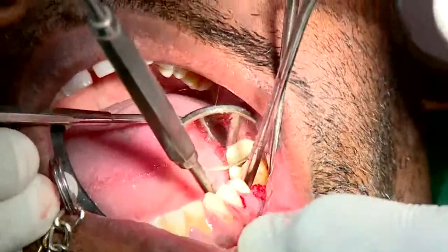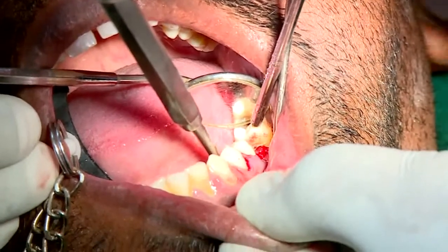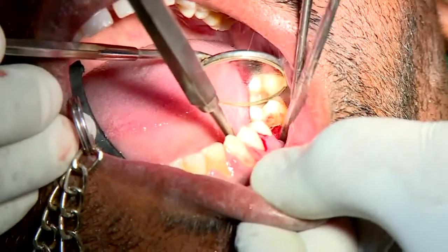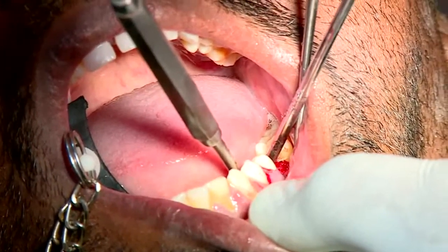Sir, can I have the pre-operative OPGs, X-rays? We will show it from the mobile. Okay, I think the film nowadays we have gone digital. That's a problem. We don't have films in most of the things. Can you focus this? Can you see, doctor? Yes.